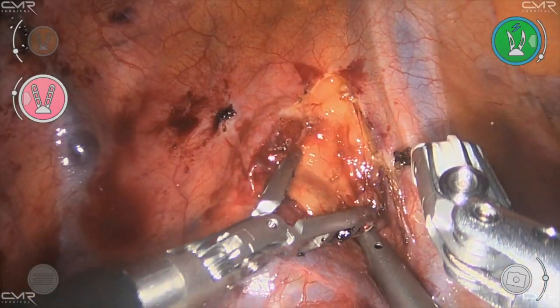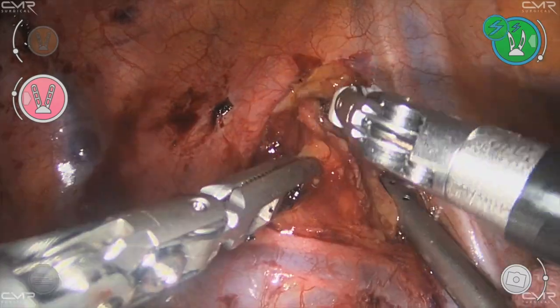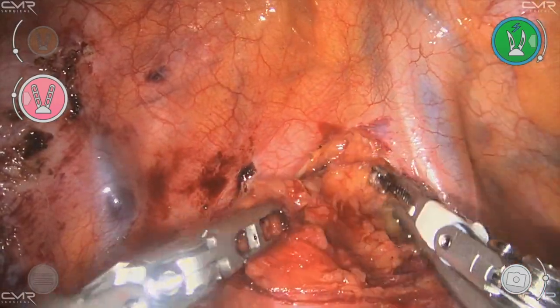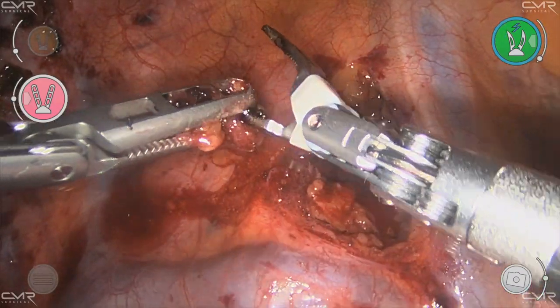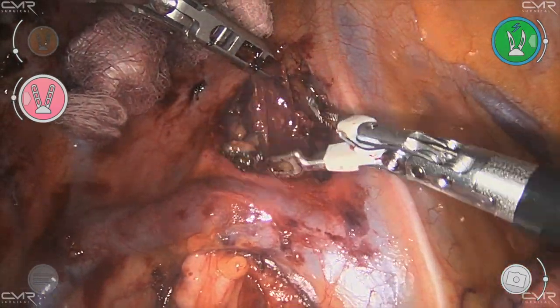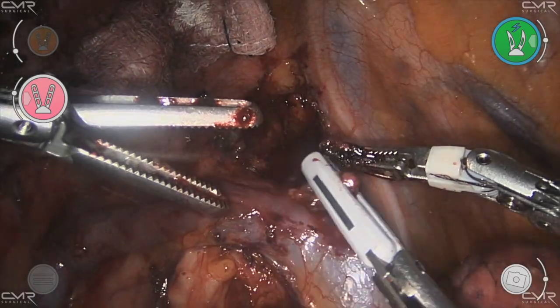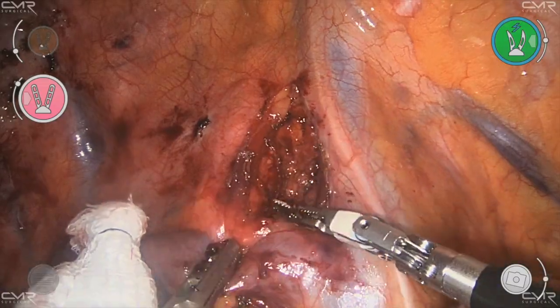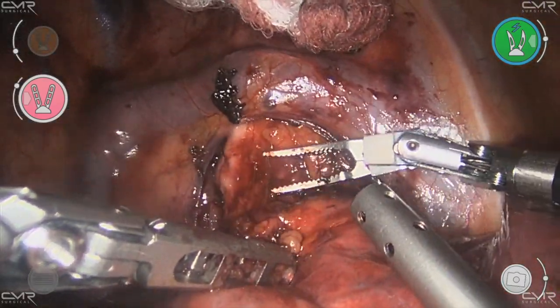We really like these rolled-up cigars — we try to keep two in the chest at all times and go through about five to ten each case. Starting the lymphadenectomy: retracting with the grasper and dissecting with the bipolar Maryland. Versus is developing very fast — advanced energy is probably within six months, ICG within six months as well. They have a fantastic Versus app so every case you do appears on your app in great detail, and a very simple SD card system for recording — very user-friendly and surgeon-friendly. Now taking out some station 4R lymph node, cleaning out. You can see the skeletonized trachea very nicely — under the azygous, over the azygous, and the trachea clearly visible.